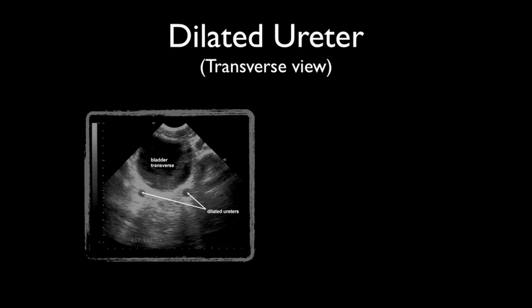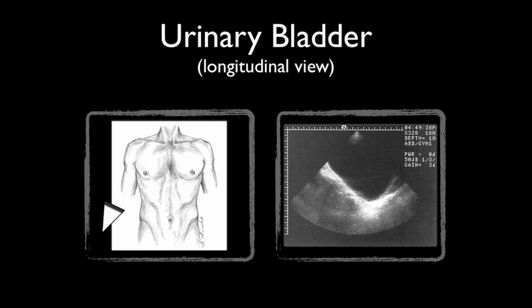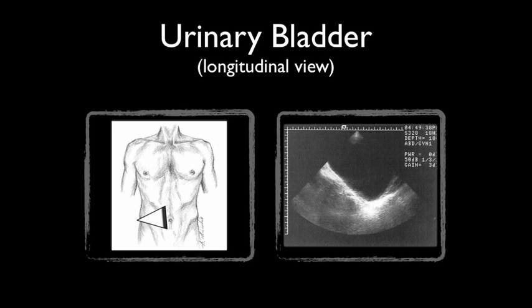Here's an example of dilated urinary ureters seen below the urinary bladder in the transverse view. For the most part, ureters are difficult to find because their view is usually obstructed by bowel. This is the longitudinal, or sagittal, view of the urinary bladder — it appears triangular in shape. Make sure the indicator marker on the probe is toward the patient's head. Confirming the position of the Foley catheter is easy. In the longitudinal and transverse view, one can appreciate the Foley catheter and its balloon apparatus within the bladder.